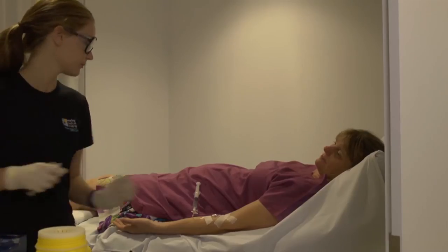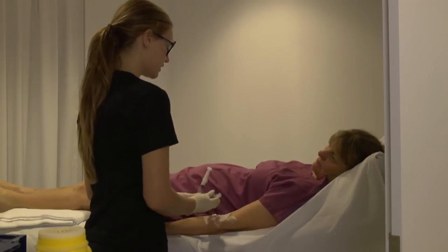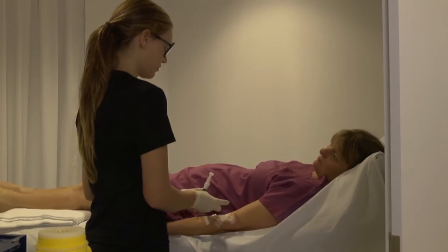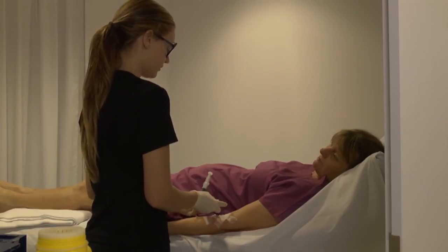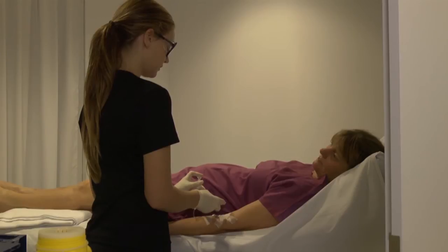The patient is then weighed and transferred to an injection room. The quantity of radiopharmaceutical injected into the patient is usually determined by the patient's weight. The radiopharmaceutical injection is prepared accordingly and then administered intravenously by a nuclear medicine technologist, just like you can see in the video.